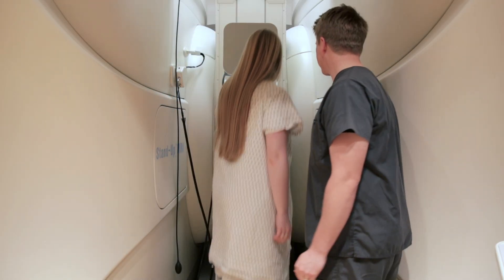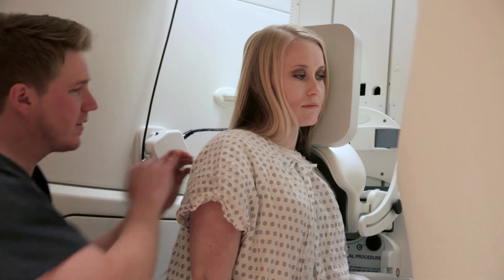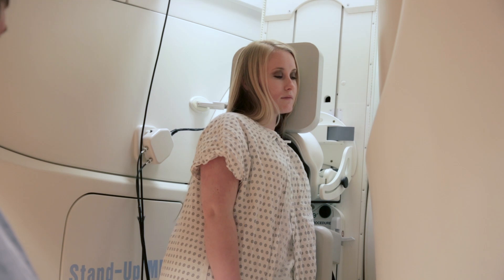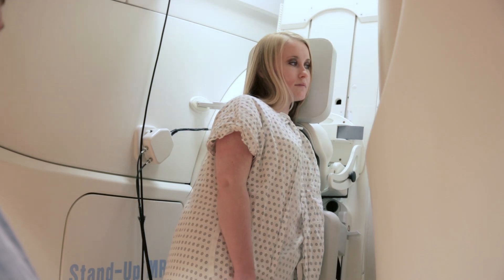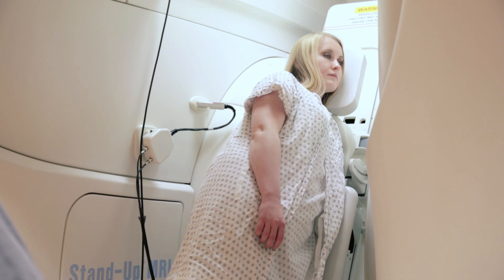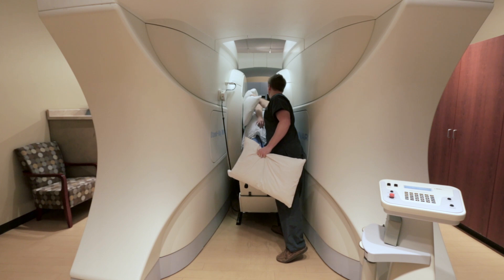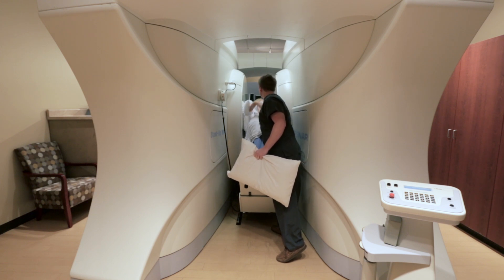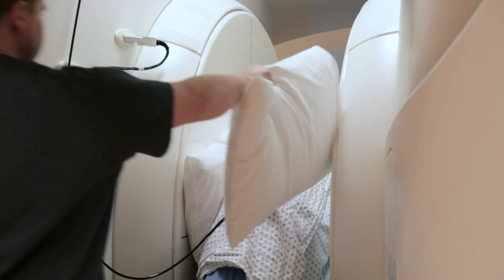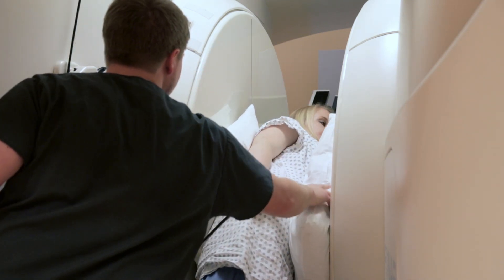Upright shoulder positioning is unique in that you're going to be laying on the side of interest. So if you're having a right shoulder done, we're actually going to have you laying down on your right side. If the patient is symptomatic and they don't feel like they're going to be able to lay on that side, then this wouldn't be something we'd recommend. But for most patients, they're able to tolerate it well, and it gives them the ability to turn their head to look out of the scanner instead of having something right in front of their face.